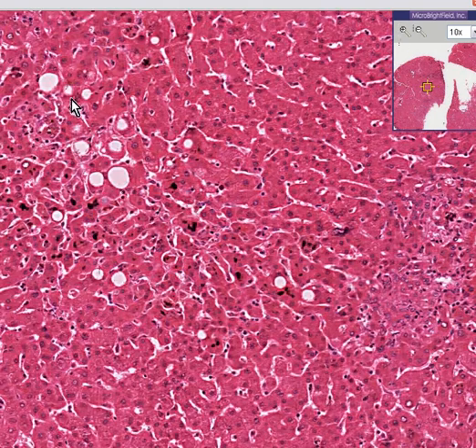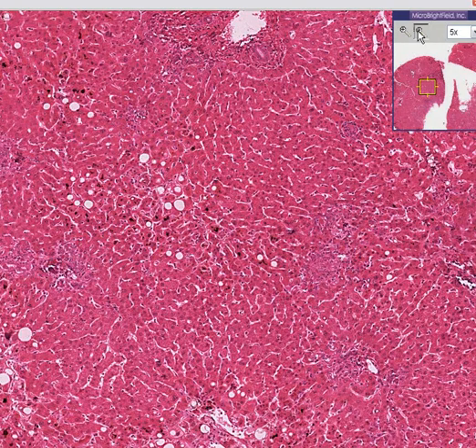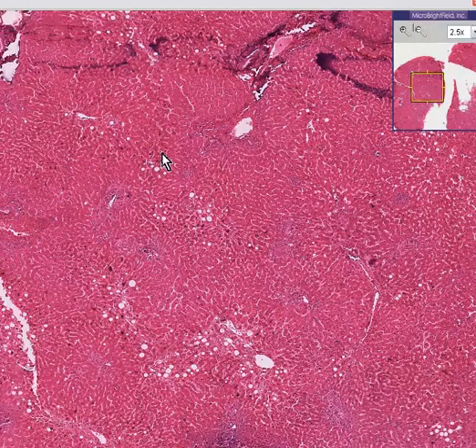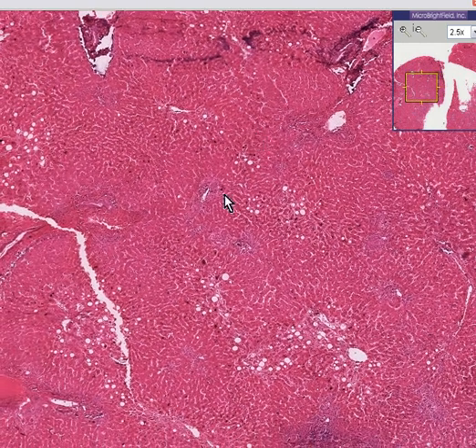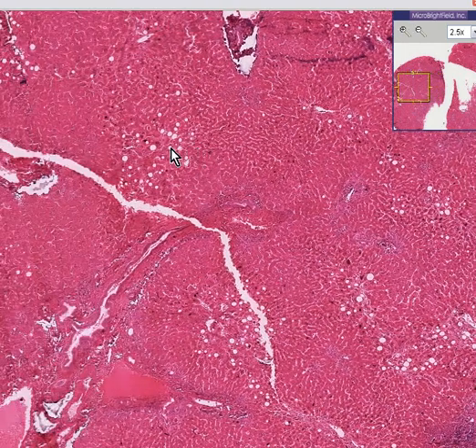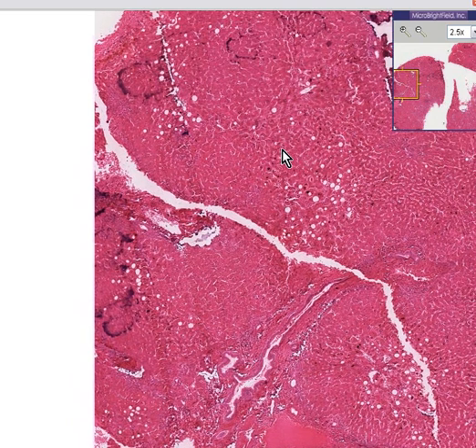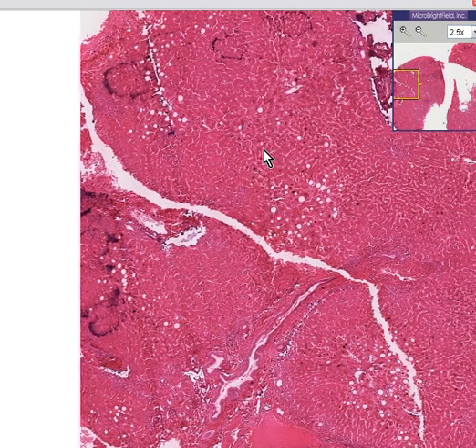Notice there's a little bit of fat in the liver here as well. The liver has an overall normal hexagonal architecture. There's a little bit of fat, as you can see, stippled throughout the liver. Here's some. You can see this little crack, which is a tissue artifact. But what else does this liver have?